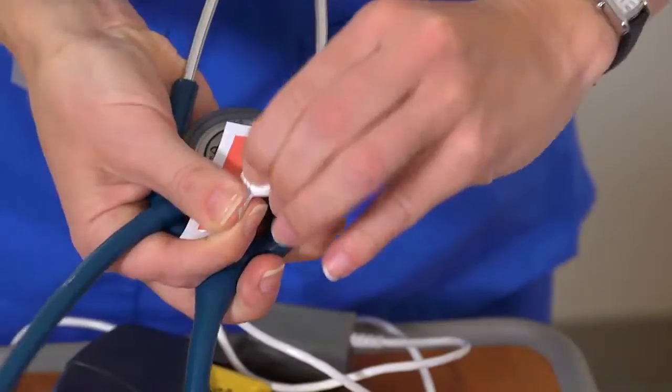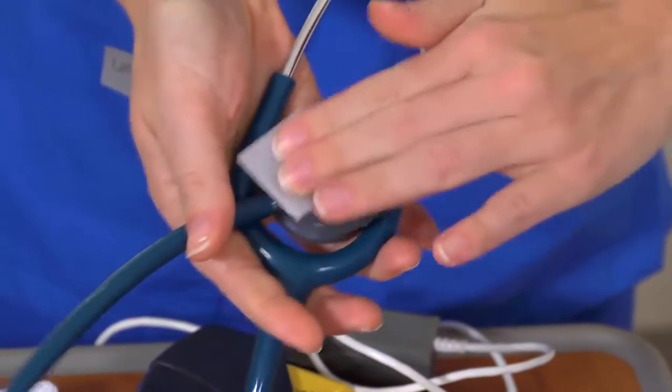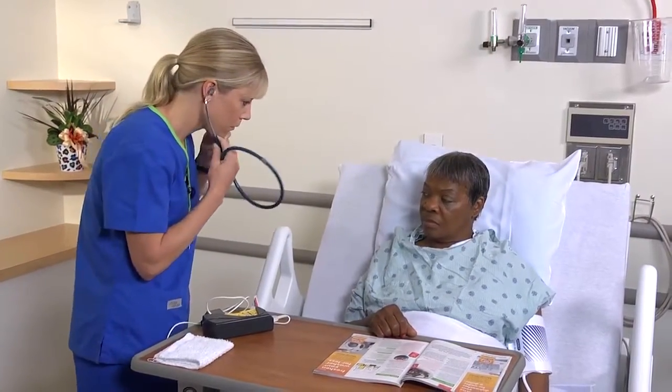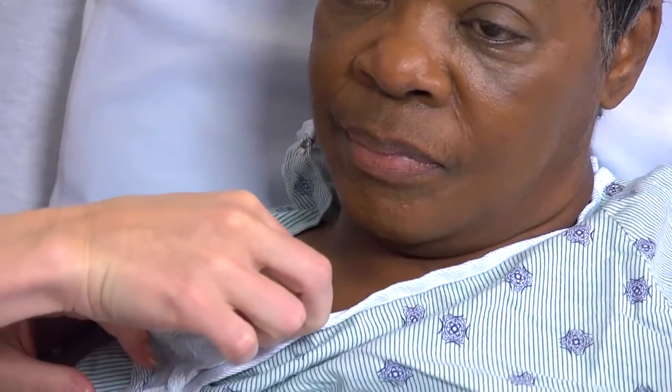First, make sure this intervention is appropriate. It may be in accordance with the health care provider's order, for example, or you can assess for adventitious breath sounds and signs of altered oxygen saturation, including cyanotic nails, lips, mucous membranes, or skin, restlessness, and difficulty breathing.